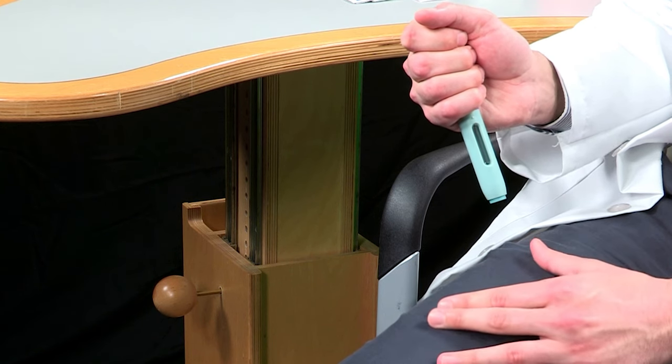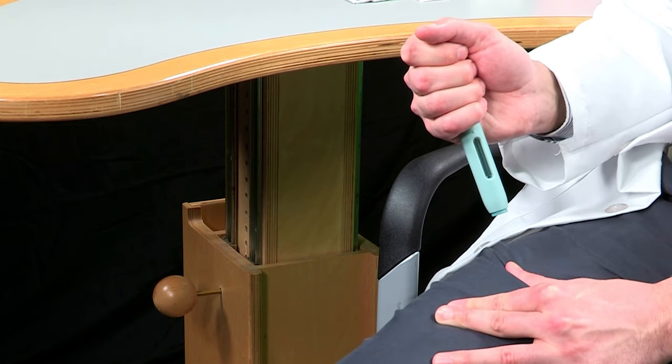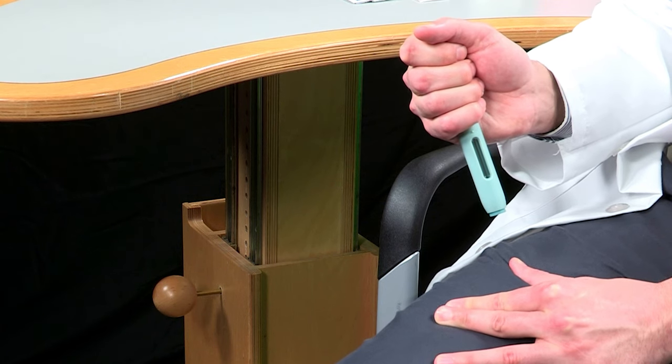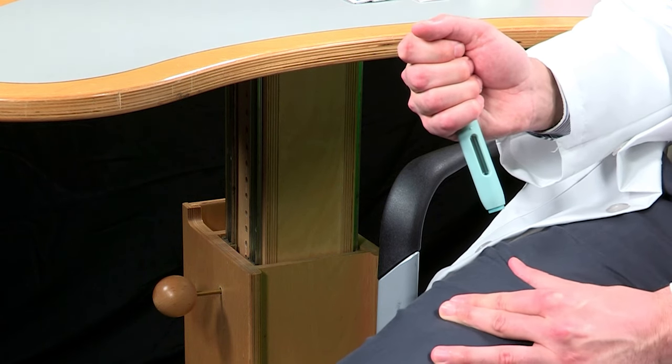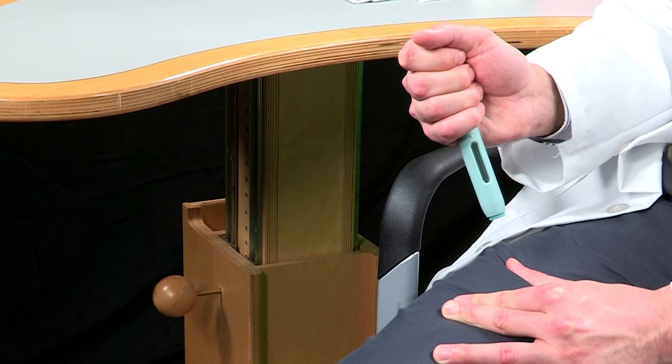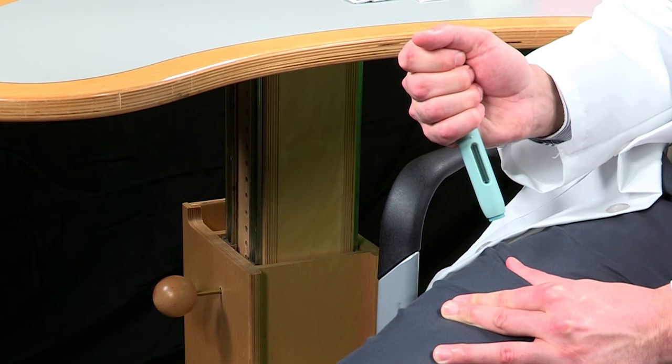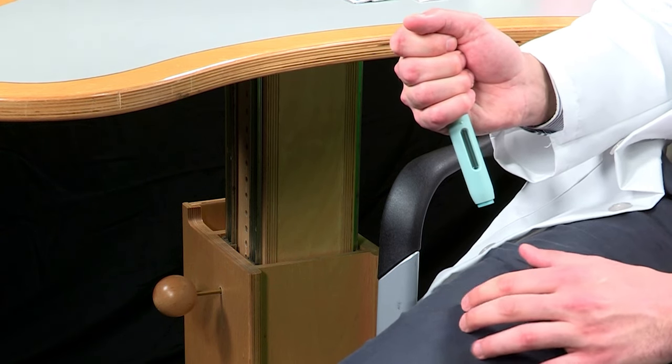For the pinch method, pinch the skin firmly between your thumb and fingers, creating an area that is also about 2 inches wide. The important thing is to keep the skin stretched or pinched the entire time while injecting.